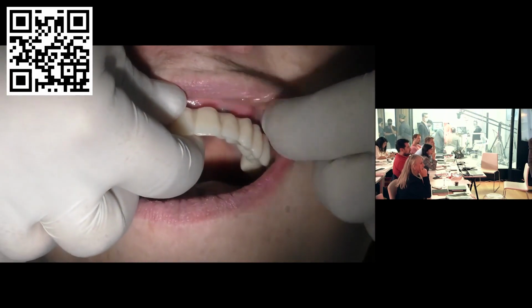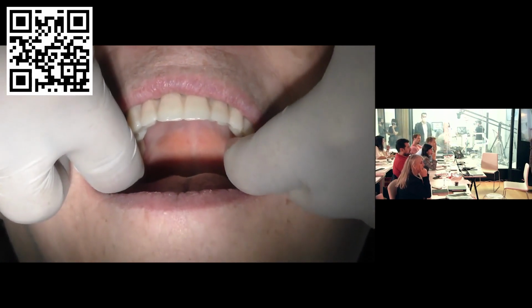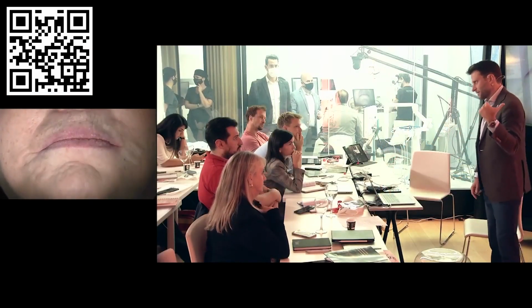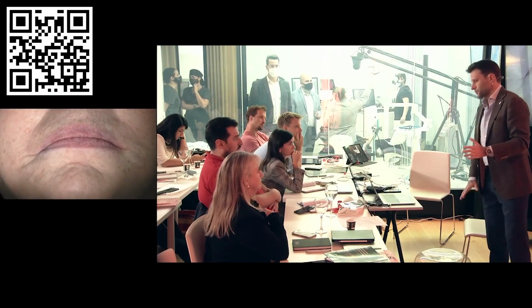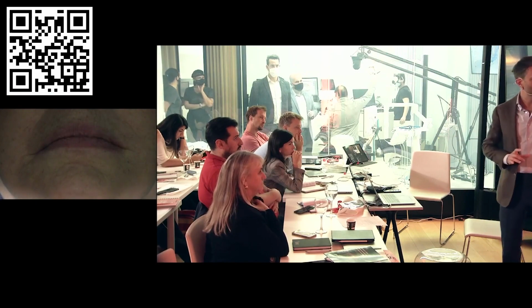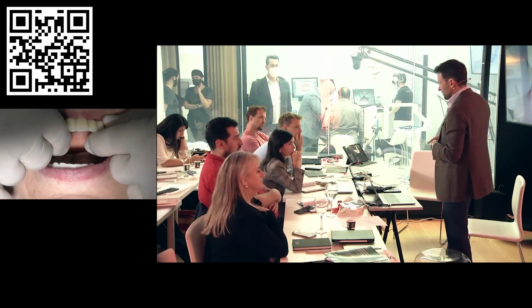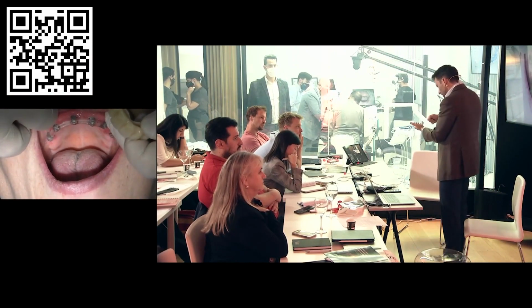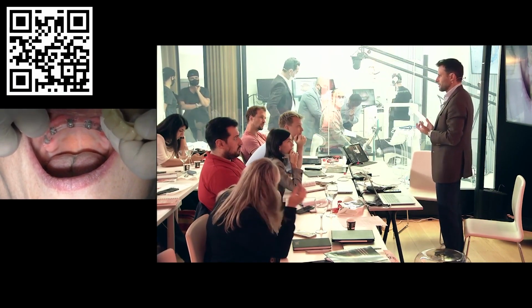So the idea of Angelo was to, with one design, do the passivity test and also use the same design to mill the PIC. But we realized that the passivity test is too thin and it becomes flexible, so it's not a passivity test anymore. So when we do the passivity test, this bar is much bigger, and that also much easier to scan. Okay, but if your scanner is not capturing it, do the silicone base on it.